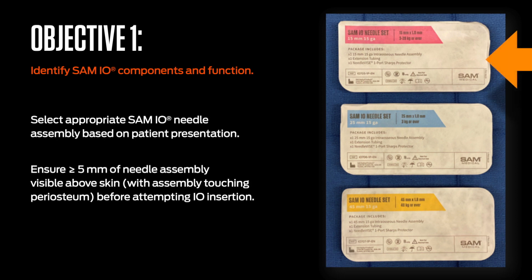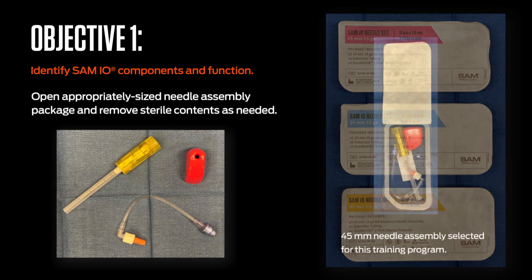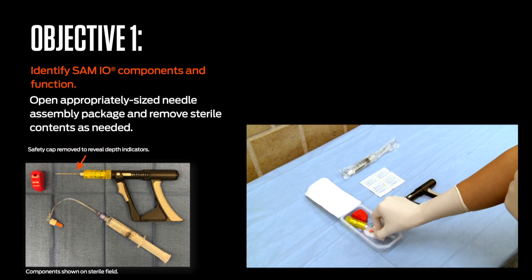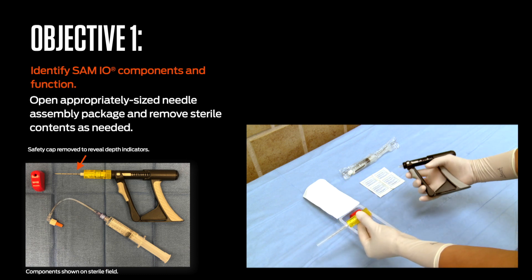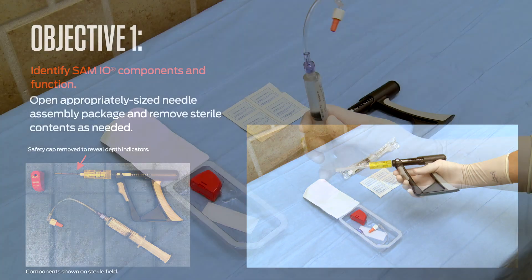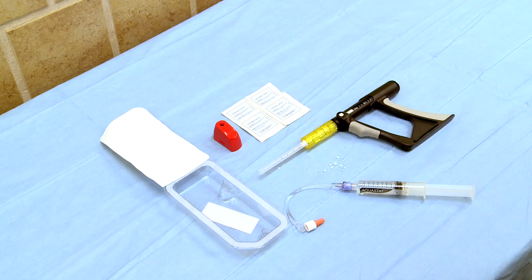The 15-millimeter needle assembly is suggested for patients with non-existent to limited overlying adipose tissue. The 25-millimeter needle assembly is suggested for patients with minimal to moderate overlying adipose tissue. The 45-millimeter needle assembly is suggested for patients with moderate to excessive overlying tissues. Contents of the SAM-IO package include one needle assembly, one extension set, and one needle vise. Note that the needle assembly has been attached to the driver, the safety cap removed to reveal the depth indicators, the extension set primed with saline, and the needle vise positioned for stylet retrieval.